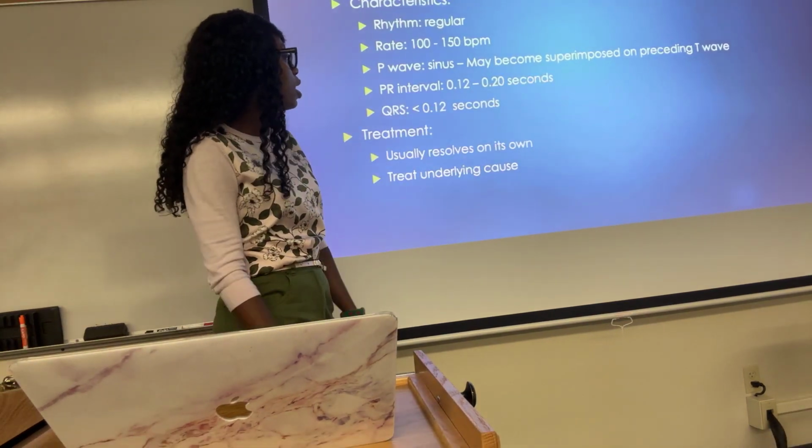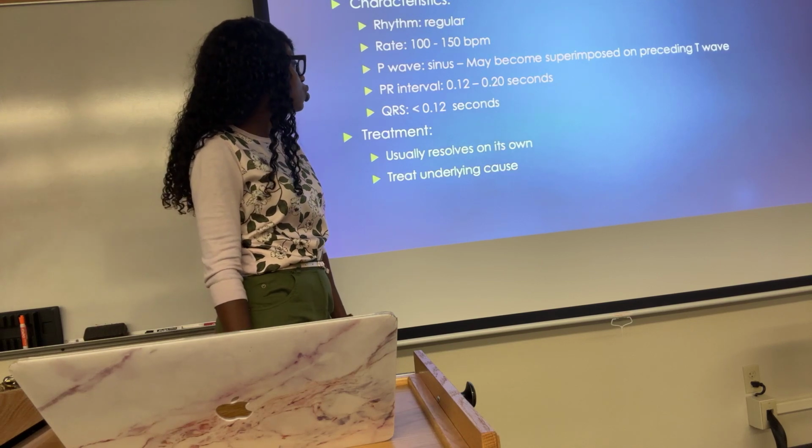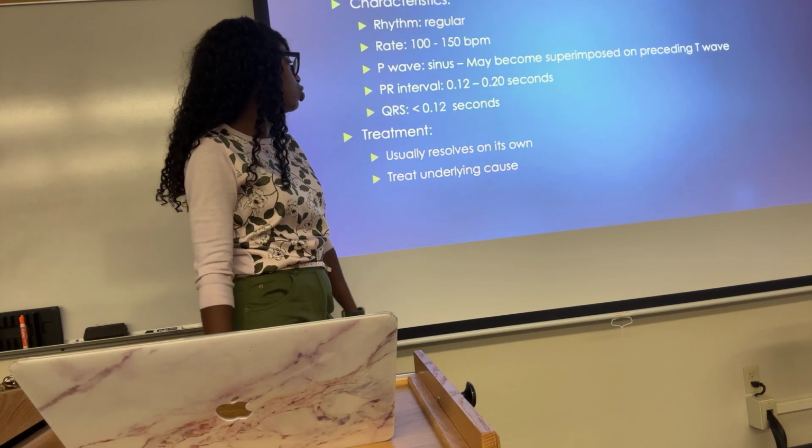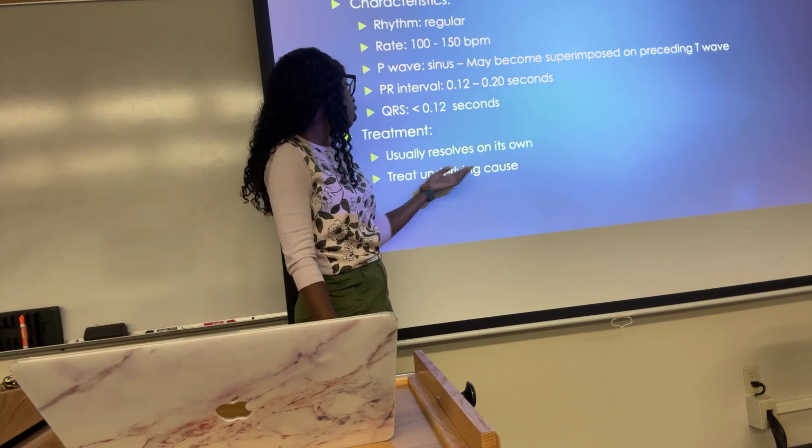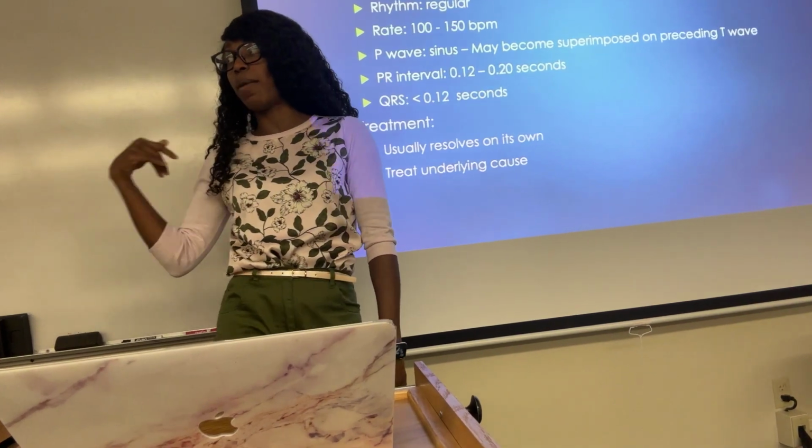PR, 0.12 to 0.20 still. QRS, less than 0.12. Treatment usually resolves on its own. Treat the underlying cause. So what is causing the problem?